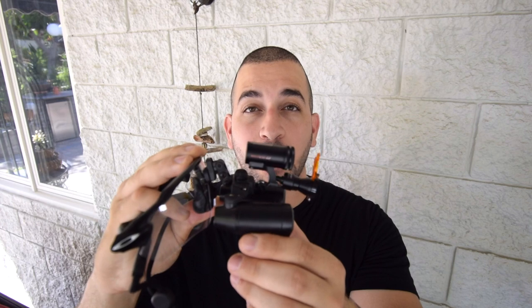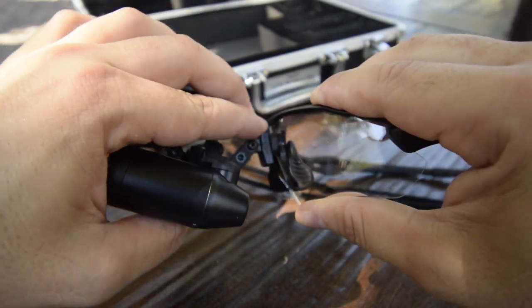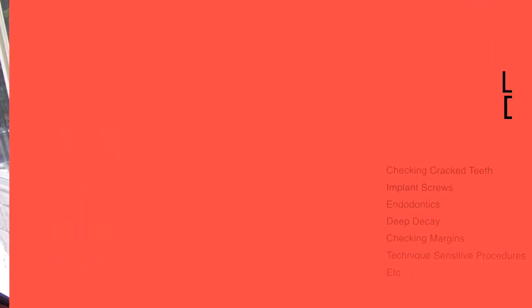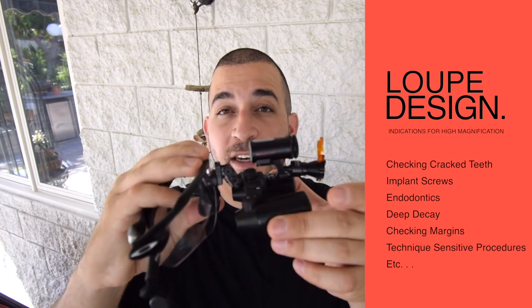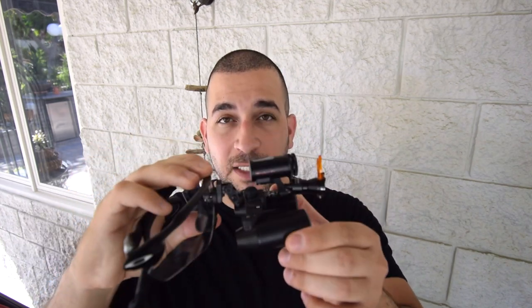Since these loops are front lens mounted, you do have the option to interchange the lens as you see fit. This freedom is actually quite nice if you want to change lenses depending on the type of procedure you're doing. For example, you may want to use a loop with more magnification to look for cracks in a tooth, and you may want something less powerful for your normal day-to-day restorative dentistry.